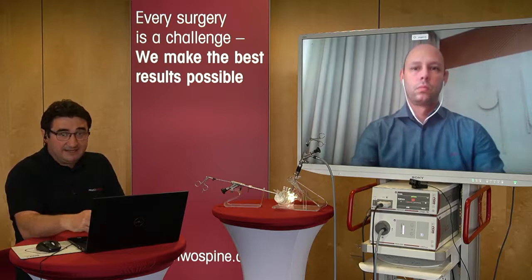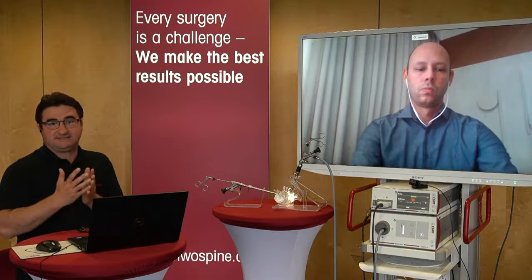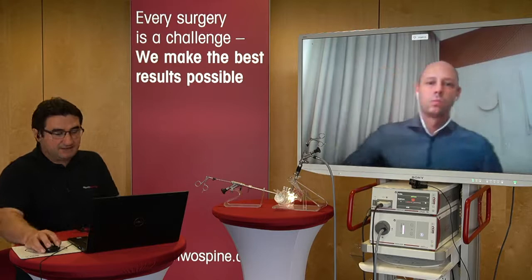And then because we understood that, we don't dissect the muscles from the bone during the surgery. This is the main advantage of the endoscopic technique. We dilate the muscles. When you remove all the system after the surgery, all the muscles close again. In my opinion, this prevents the CSF leakage after the operation. Yeah, I can comment like this. Maybe it is the same. Yes, perfect. Perfect explanation.